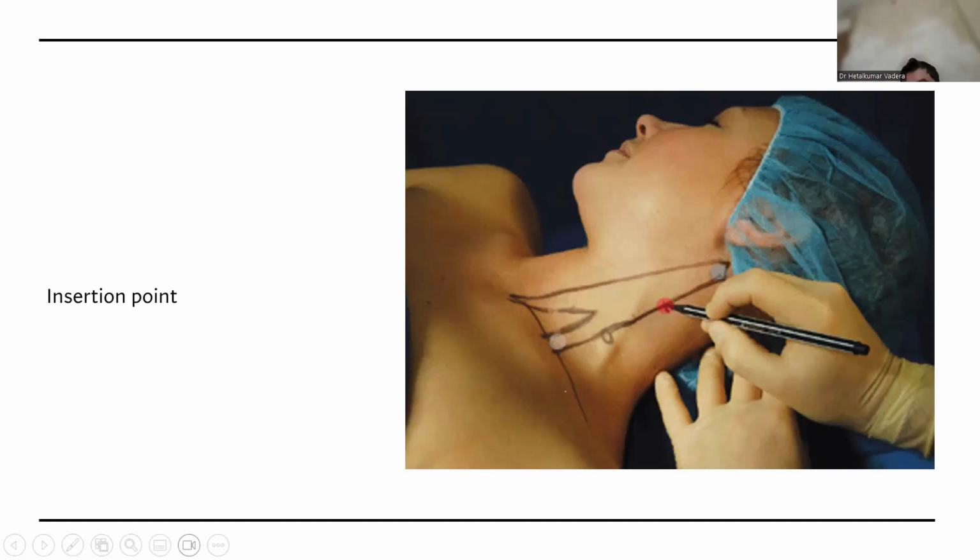Regarding mandibular nerve block, we are using it regularly, and sometimes I've observed that even if you aspirate, you don't get blood. But if you are using PNS, I've seen that even if you are intravascular and your needle tip is close to the nerve, you get the contraction. So when you inject the drug, it will not lead to disappearance of the muscular response. So there won't be a positive Raj test. Even if you inject 2 ml of the drug, the motor response will remain there. In that case, you have to be suspicious about intravascular injection.